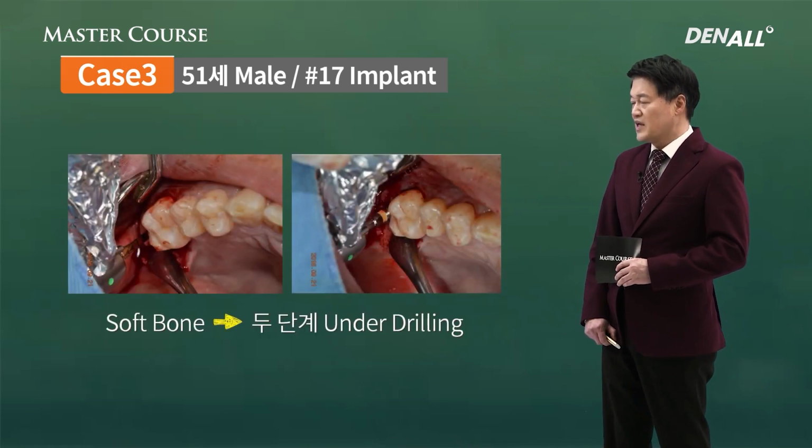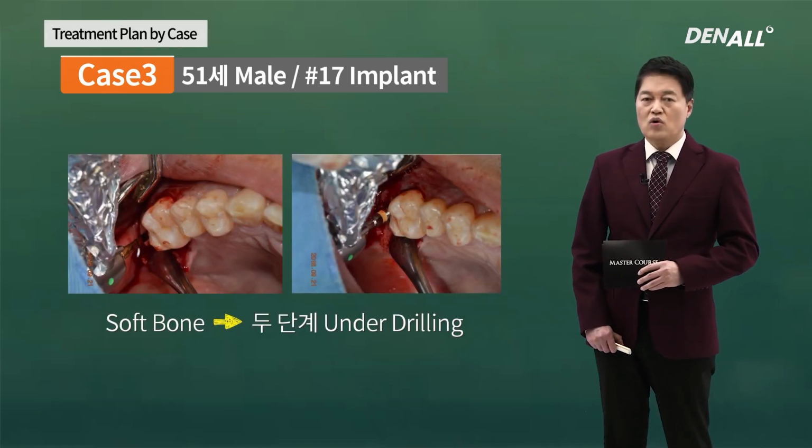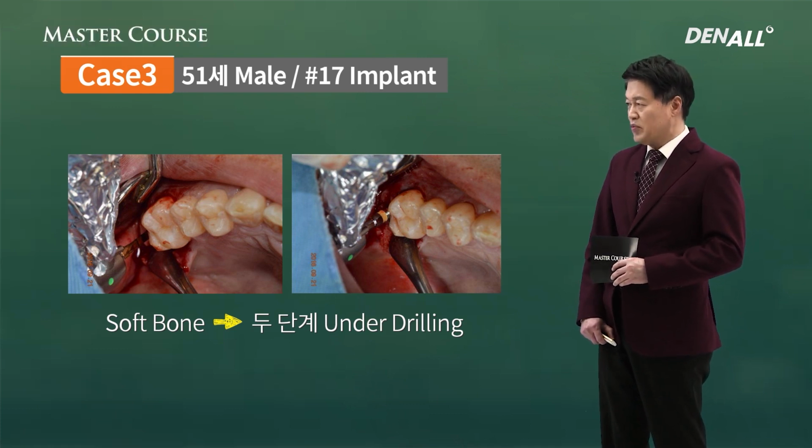After that, I proceeded with implant drilling. The important thing is you need to check bone density. As you drill, the resistance tells you whether it is soft bone, normal bone, or hard bone. You need to evaluate it.